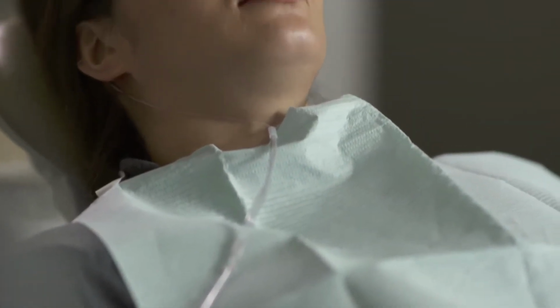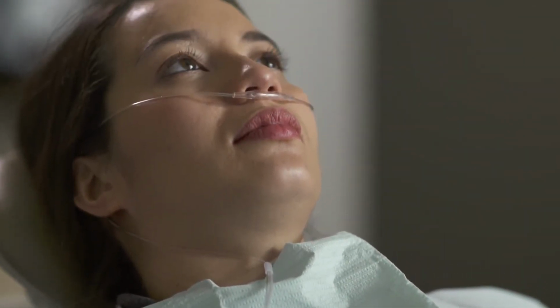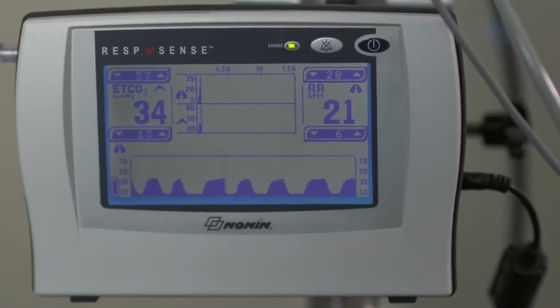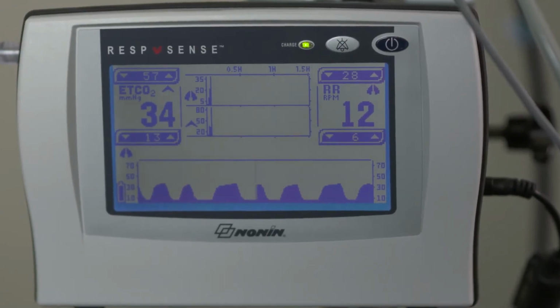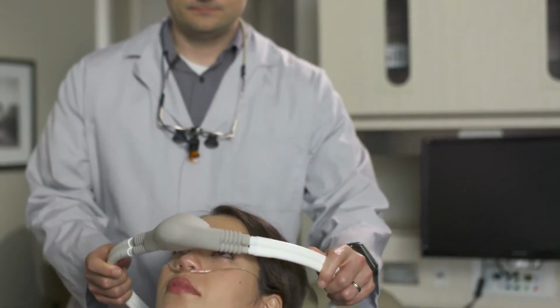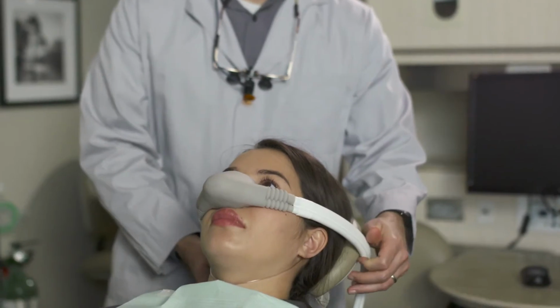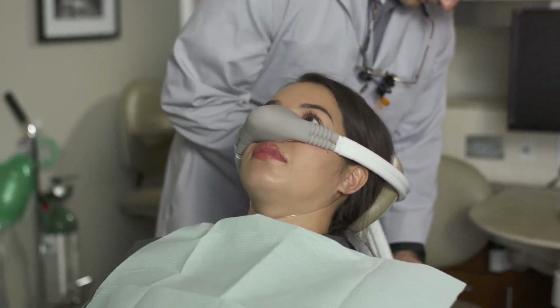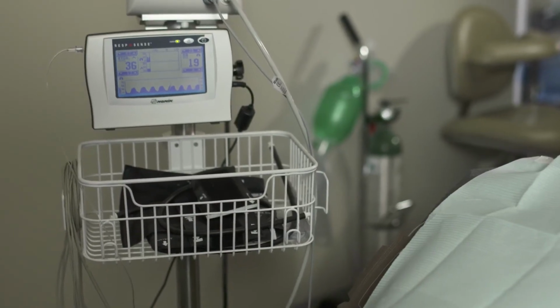Next, place the cannula on the patient and attach the connector to the moisture trap inlet. You can use a nasal cannula or an oral nasal cannula to capture airflow from the mouth. Some cannulas deliver oxygen at the same time they sample CO2. Take a baseline reading of the patient's end tidal CO2 and respiration rate before applying a nasal hood. Flow from the nasal hood can affect the CO2 reading due to turbulent flow inside the nasal hood. Check the patient's readings again.